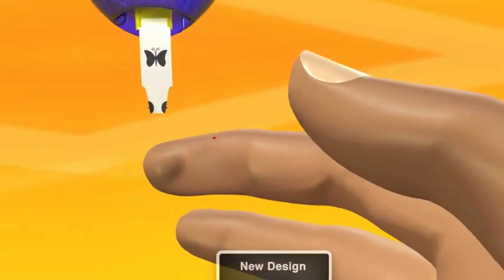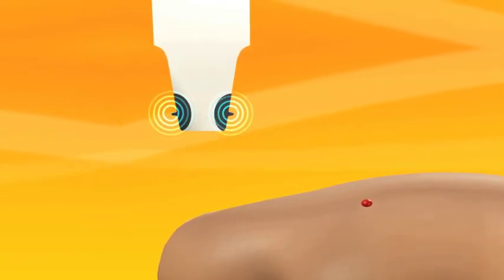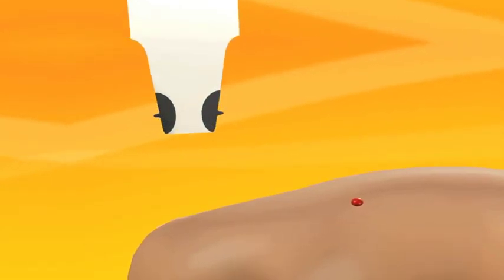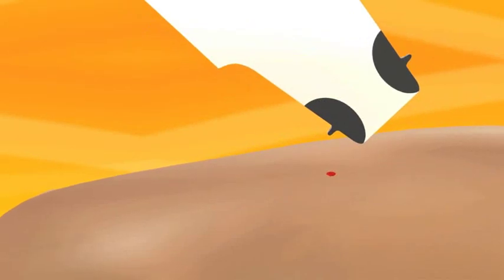Let's look at the technology behind the innovative ZipWik design. The dual side-field tapered design simplifies blood application and maximises a patient's first test success. When the ZipWik tab touches the blood drop, it breaks the meniscus or blood surface and instantly wicks in the blood sample.